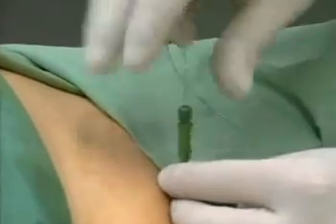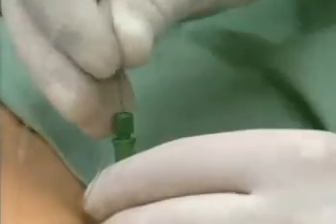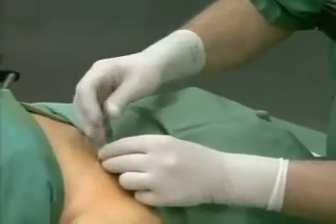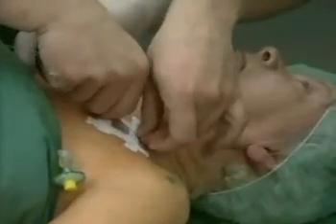The catheter is advanced 3 to 4 centimeters beyond the end of the introducer. The catheter is fixed with bandage strips and then wrapped with a sterile dressing.